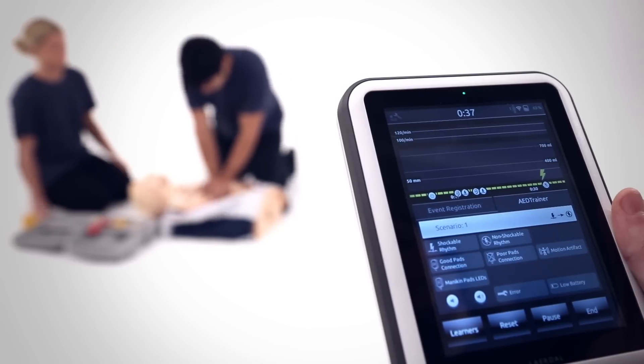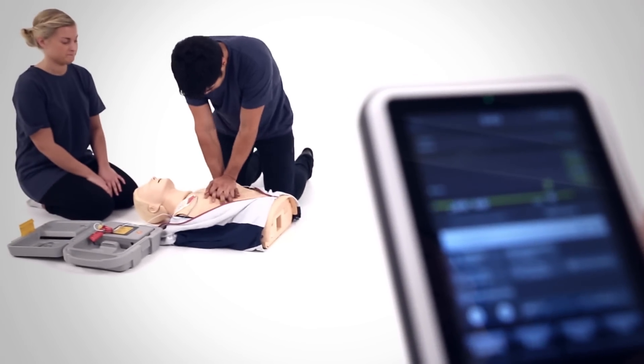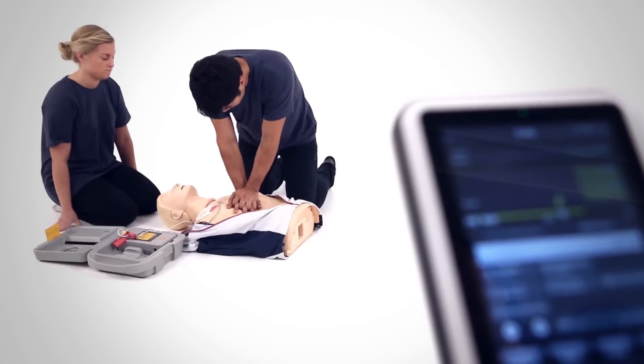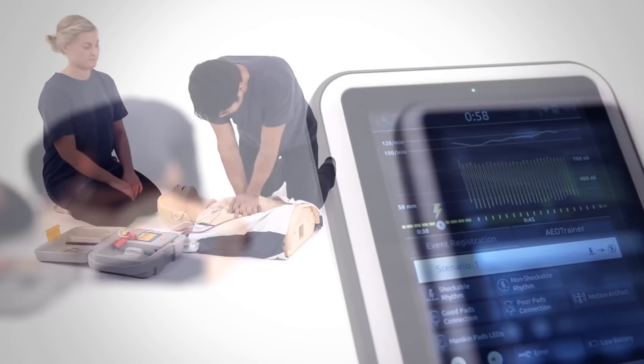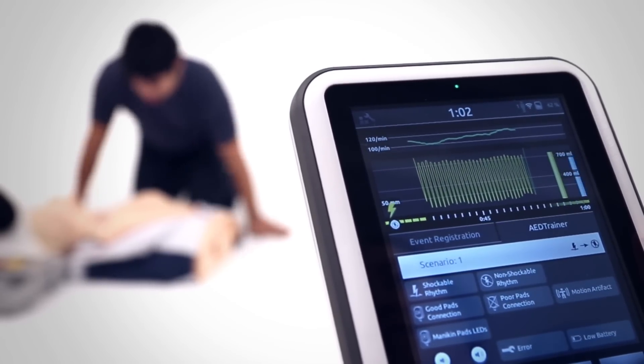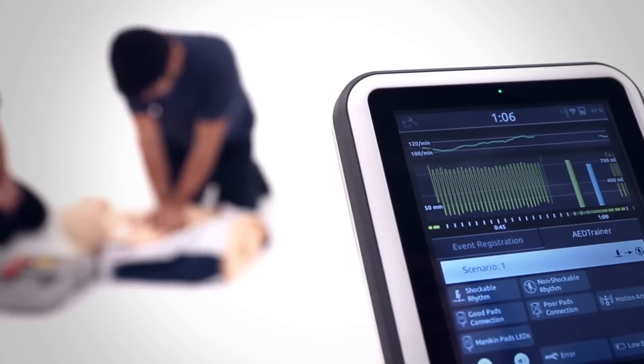Sympad's Skill Reporter can be connected to Reisussian QCPR with AED Trainer 2 and 3 for detailed feedback and debriefing when training students to use an AED. You can operate with AED Trainer 2 and 3, as well as adding events into the timeline.